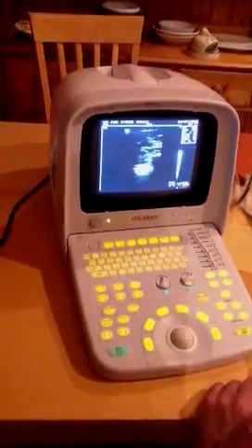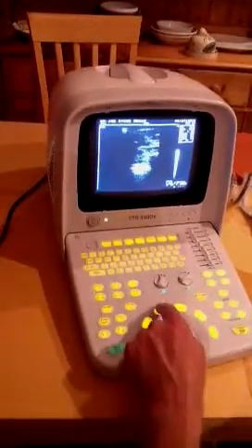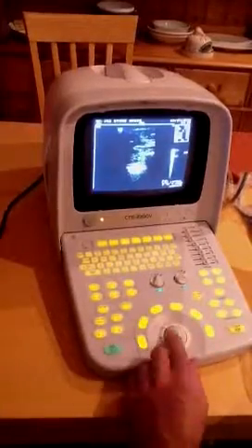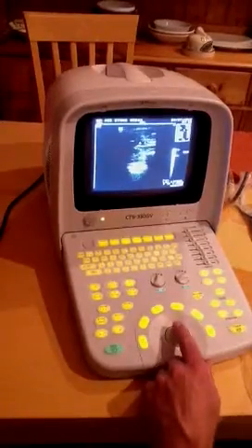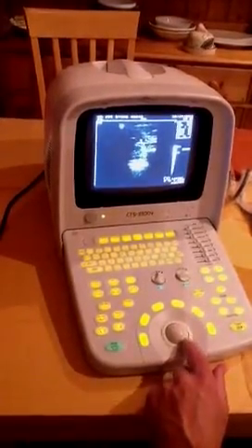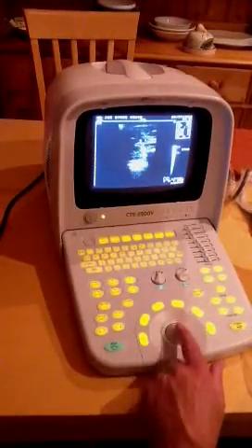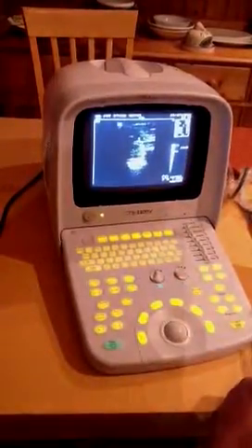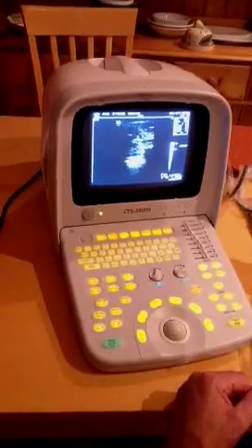If you want to do an area measurement, you press freeze, then press the area button. You'll see the cursor flashing — press enter and you can scan whatever it is, for example a tendon. You can see where you bring the cursor, and the distance measured is displayed, so you'll be able to scan tendons quite happily on it.